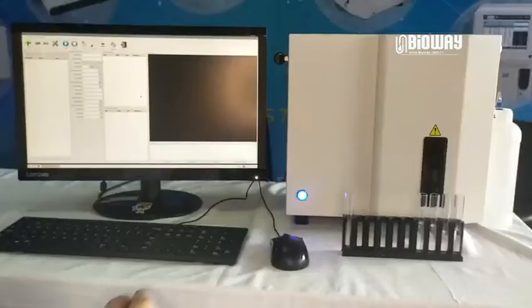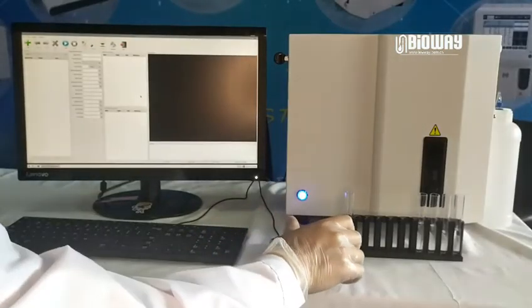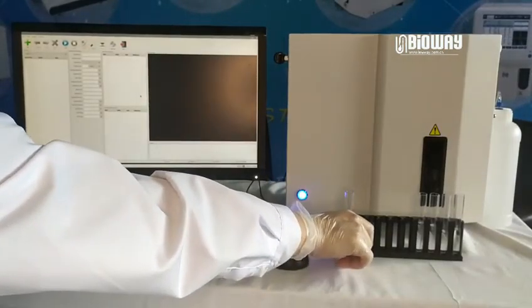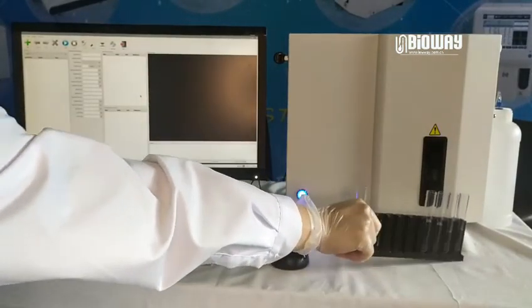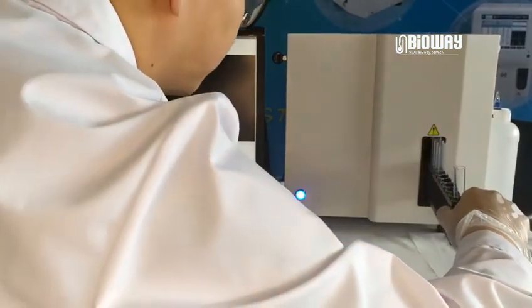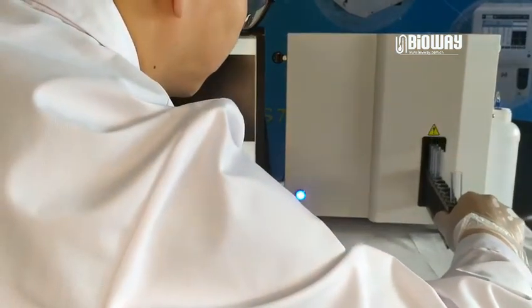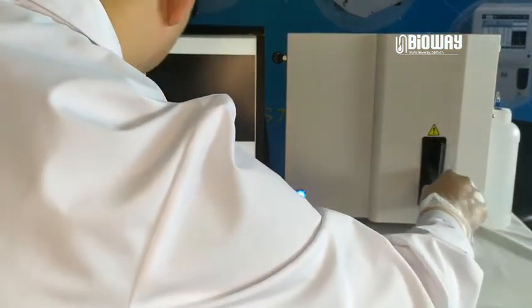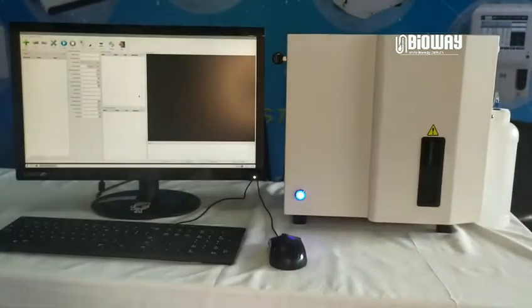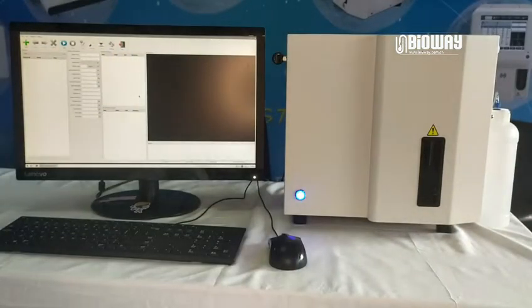When the system is ready, push the tube rack into the machine from the slot in front. Please notice the rack must be pushed in to the end of the track.